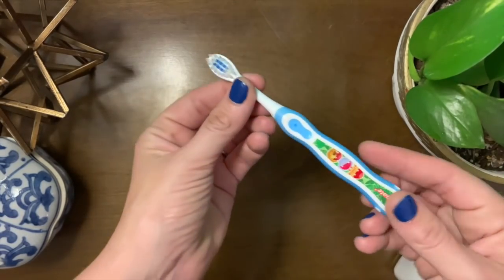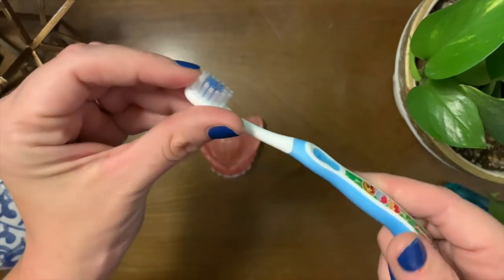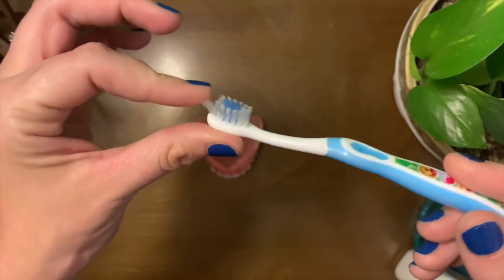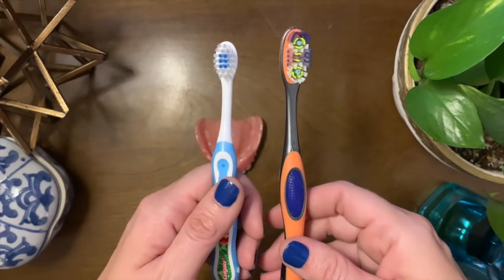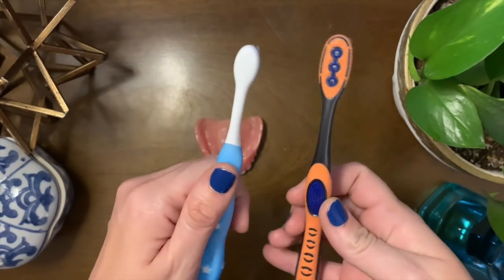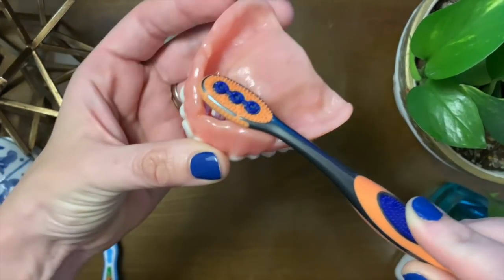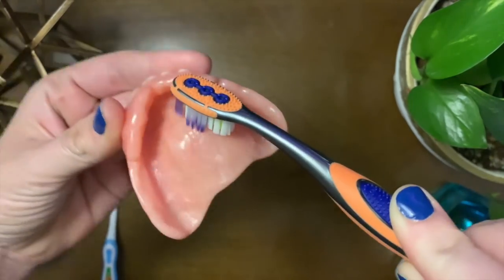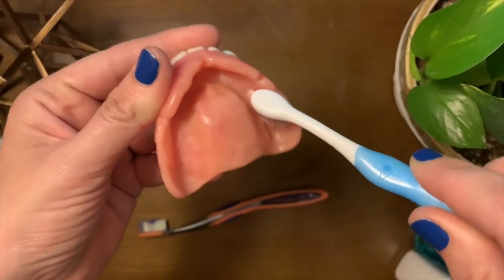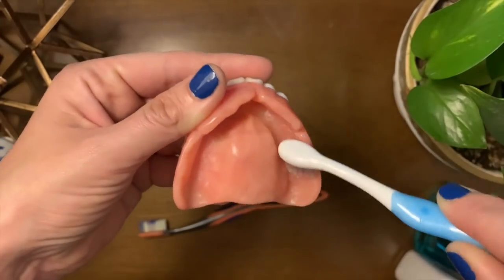The next thing that I got was a toddler toothbrush. Now I know there are brushes especially made for dentures — they come with one larger brush and a smaller brush on the other side to get into the smaller crevices. But the problem is that they are very hardcore and very abrasive; it feels like the kind of stuff you'd scrub your toilet with. You don't want to scratch your dentures. The toddler brush gets into those crevices and it's got soft bristles, so it won't damage your dentures.